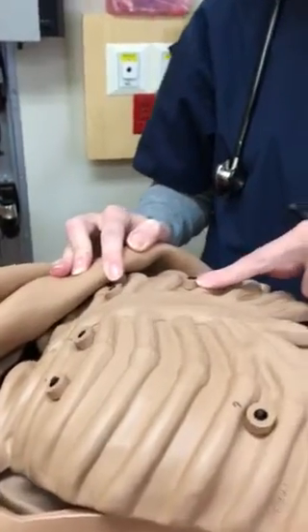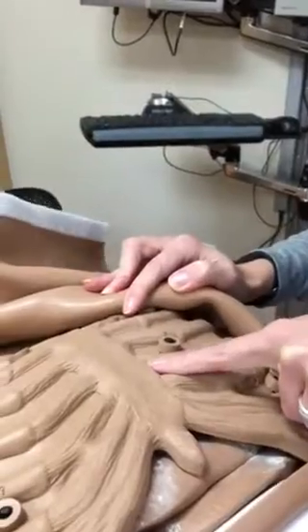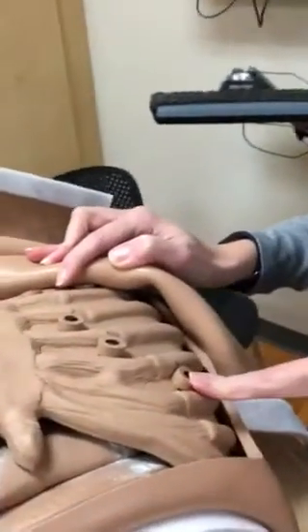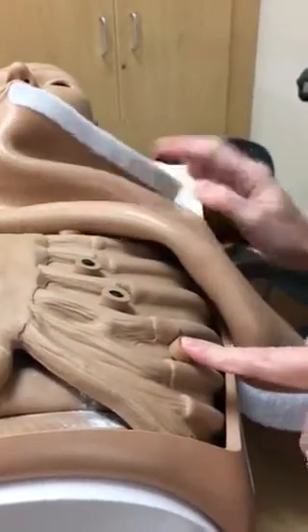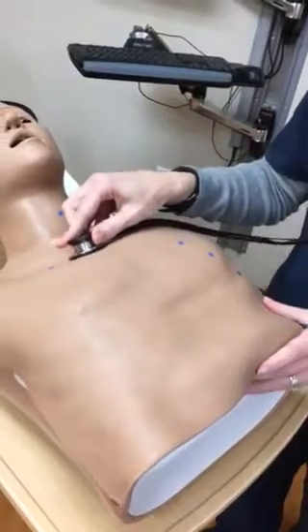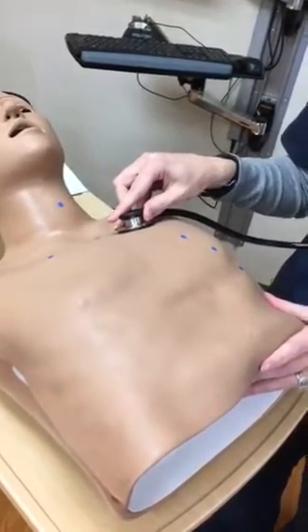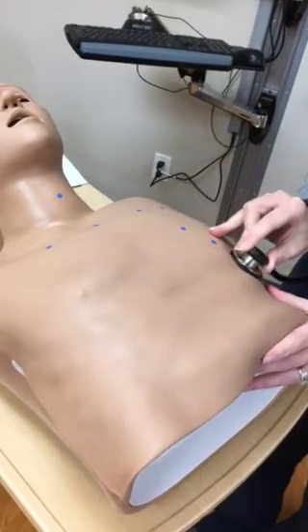You're going to go down to the 4th or 5th intercostal space, right still at the left of the sternal border. That's our tricuspid. And then you're going to move to the 5th intercostal space, left midclavicular line, and that's our mitral. Okay? So then we'll go ahead and we're going to listen. So listen, move across, pulmonic, going down to tricuspid, and then mitral.